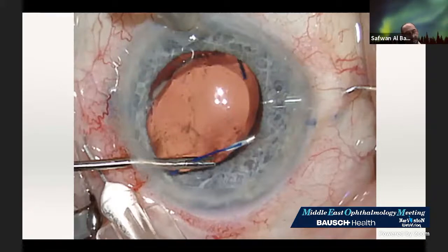Now, Dr. Brian, he mentioned all the issues, a modification on double needle. The double needle wasn't in the original steps. When Yamani created the first surgery, it wasn't with the double needle, but because of the complication, that one side of the haptics is not cauterized, so we will lose that haptics, or we will lose the lens, he created the double needle.